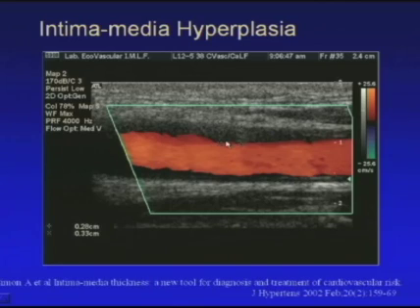It's important, the place where you make the measurements of the Intima-media. These measurements must be done 1 centimeter before the carotid bifurcation. It is important that all the labs and everyone make the measurements at the same place, because we can make a proper follow-up of these patients, in order to see the progression of the disease or, for example, the response to medical treatment.